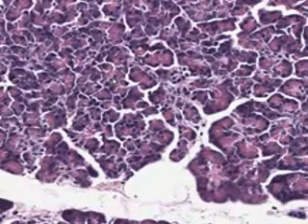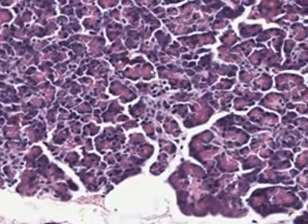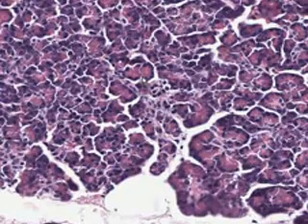The exocrine glands, the unit is an acinus. An acinus is a small group of 5, 6, 8, 10 cells in which you have a lot of granules in the inside, and the nuclei are pushed towards the periphery. This is the typical acinus.